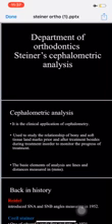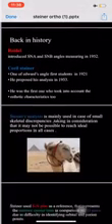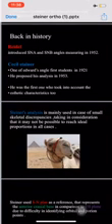لهذا، Steiner تعتبر واحدة من الـ analyses اللي استخدموها الأطباء لغرض تسليط الضوء على الـ bony discrepancies and soft tissue profile, and the aesthetic considered as an important point. Back in history, Riedel introduced SNA and SNB angle measuring in 1952.